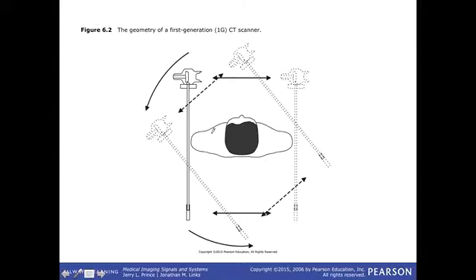But those doses are very, very high. For that to occur, you need a lot of X-rays. We're usually working down on doses that are low. But ideally, we want to use the doses that are just enough, right, to get, say, 50% of the X-rays stopped and then 50% detected. So we have a nice translucent object. We can go into more details about that stuff if you're interested.